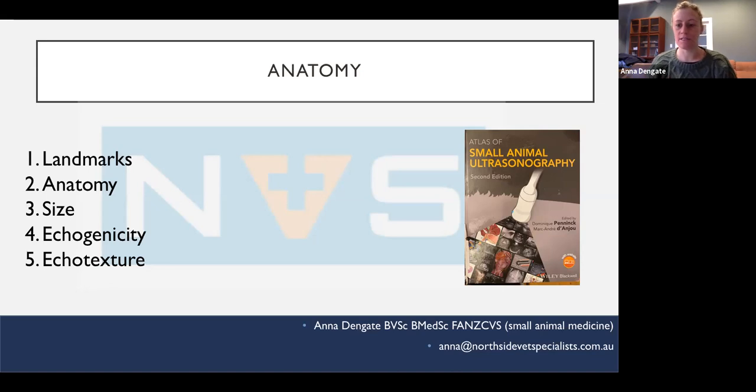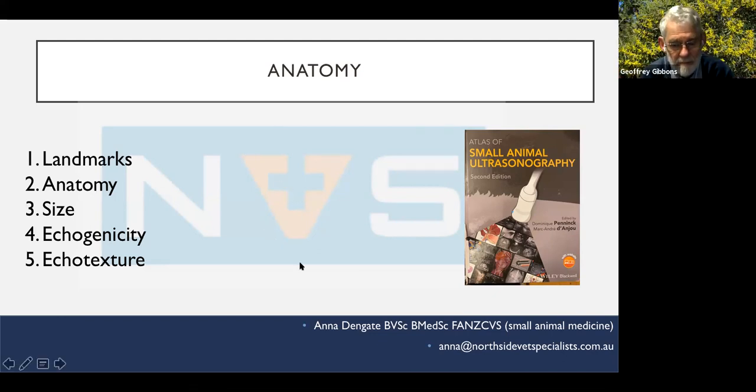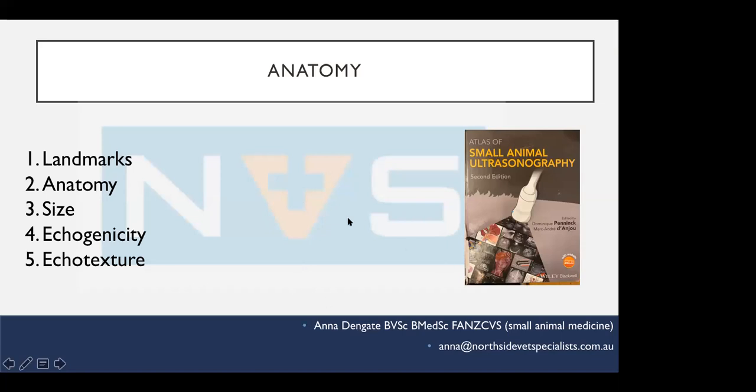The other thing I usually do is, if the dog's lying on their back, I put the probe right up just below their sternum, the cranial-most point of the abdomen, and I point the probe directly at their spine. I want to see the liver entirely on the left-hand side of the screen, on the cranial aspect of the screen. I don't want to see it crossing the midline and in the caudal aspect of my wedge. Does that make sense without a diagram? Probably not. Did you say you put the probe at the sternum, perpendicular to the dog, pointing straight up at the spine? Exactly, yeah.